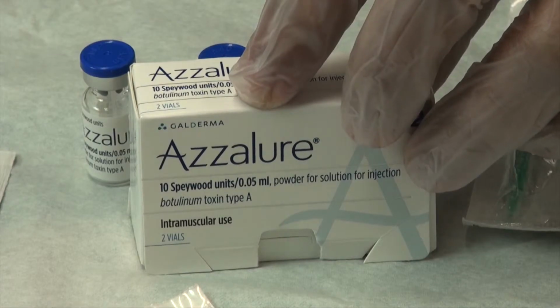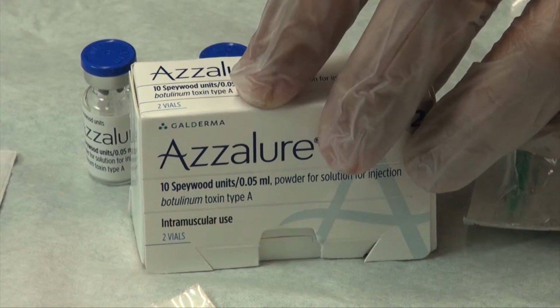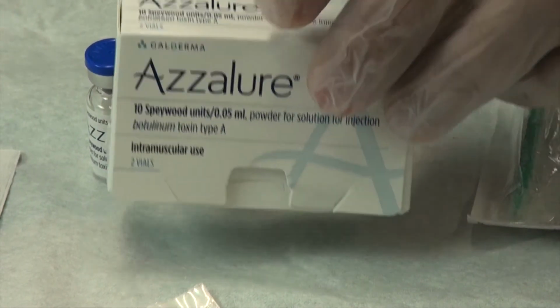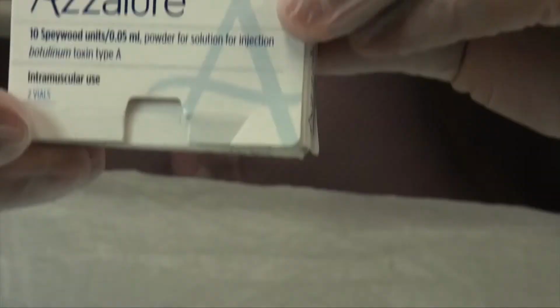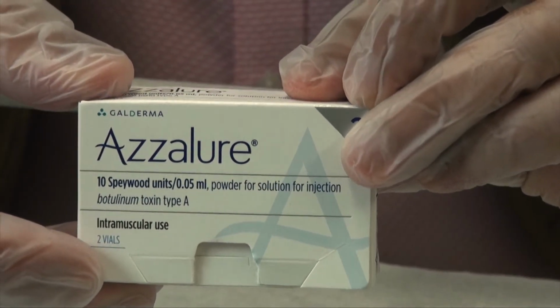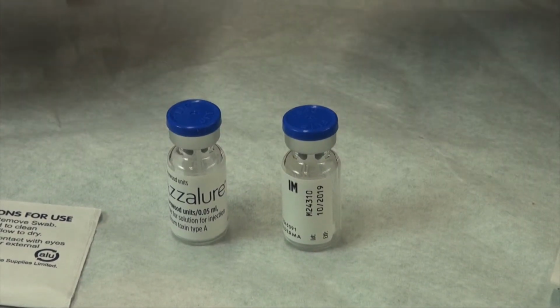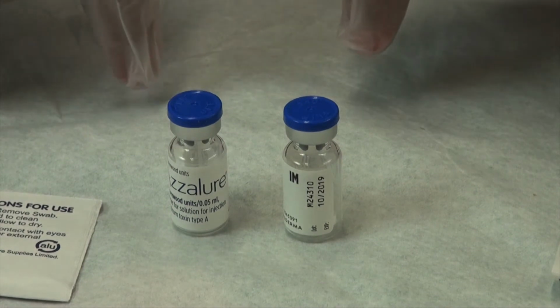Now for the reconstitution of Azzalure. Azzalure is a toxin that is measured in Speywood units, or SU. The Azzalure box comes as shown, and inside that box are 2 vials of toxin. Each of these vials contains 125 Speywood units of toxin.